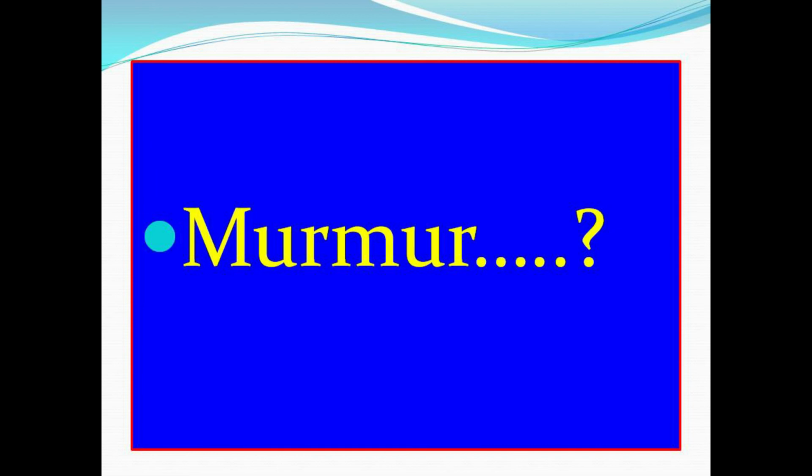The features of the murmurs vary regarding timing, whether systolic or diastolic, pitch, frequency of sound, low pitched or high pitched, quality, intensity, location, radiation, etc., which vary with the area of involvement. So the same set of murmurs can be well heard with the bell of your stethoscope.